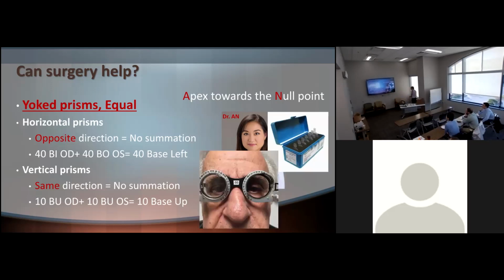And we have some trial of loose prisms, but they are Fresnel prisms, because you can imagine when you hold 40 or 50, it can be very thick. It's confusing. But this is like a trial lens with built-in Fresnel prism that you can try in the clinic in certain situations.